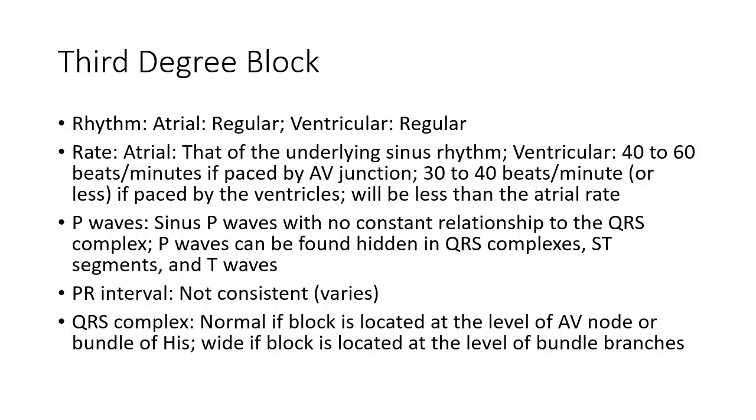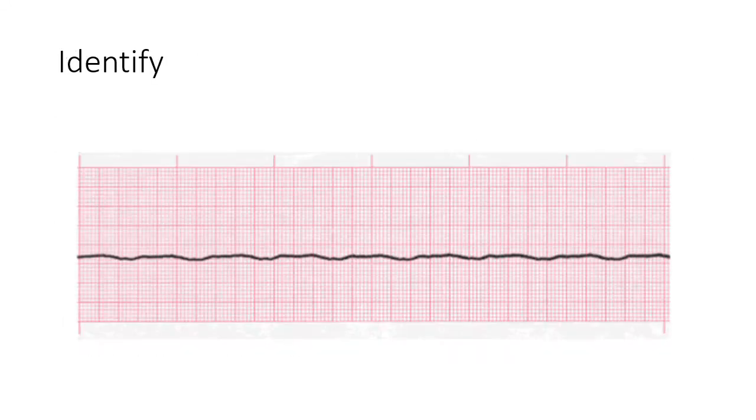Awesome. All right, now, Blake, this is a tough one, okay? Take your time, all right? So don't let me fool you. Is it normal? Please tell me you're joking. Yeah. My second guess was asystole. Okay. Well, let's go with your second guess.